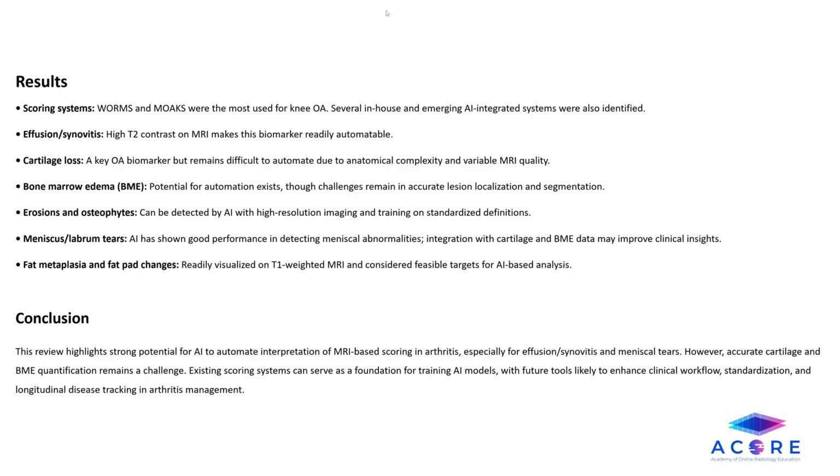On the whole, this review outlines the feasibility of automating complex semi-quantitative osteoarthritis scores with refined imaging and training datasets. AI holds very strong promise in supporting clinical trials and patient care when looking to move arthritis management forward in the future.